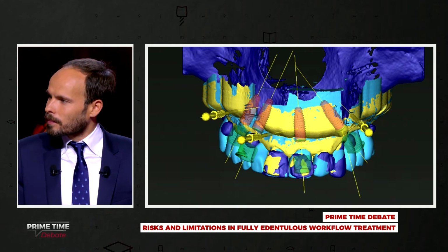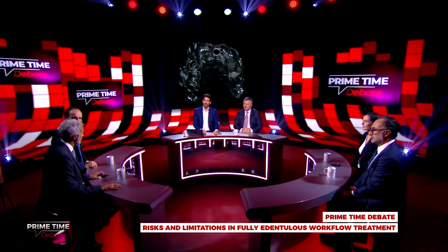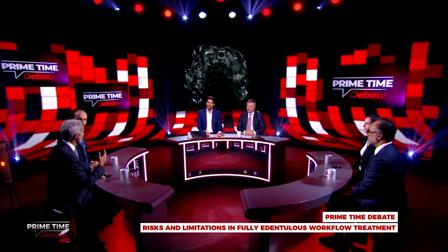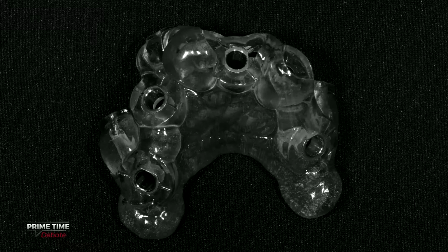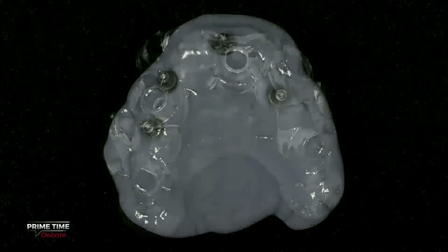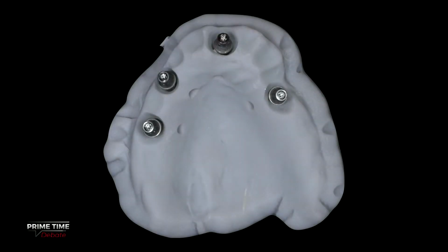Yes, and we move from the analog to the digital part, and then the dental technician is able to print the surgical guide as shown before. In addition, he will be able to print also the model with the implant in position prior to starting the surgical phase.